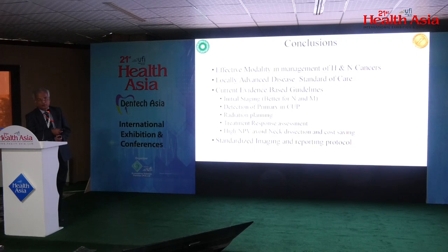But at this point, before terminating my talk, once again, I would like to reiterate the important finding and recommendation that standardized imaging and protocol is of utmost importance when we are using the follow-up FDG PET-CT for metabolic response assessment.